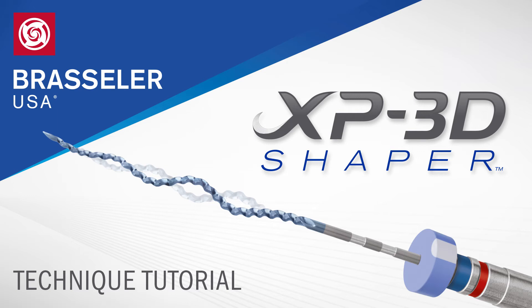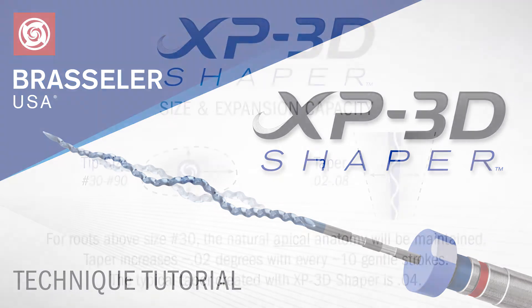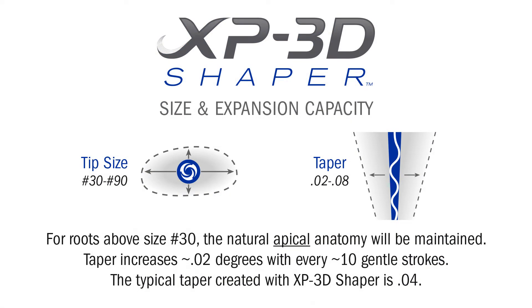The following is a brief tutorial explaining the recommended technique for using the XP3D Shaper. The Shaper will adapt to canal morphology ranging from size 30 all the way up to size 90. Because the core of the Shaper is a 30-01, it will always shape tight canals up to a size 30.